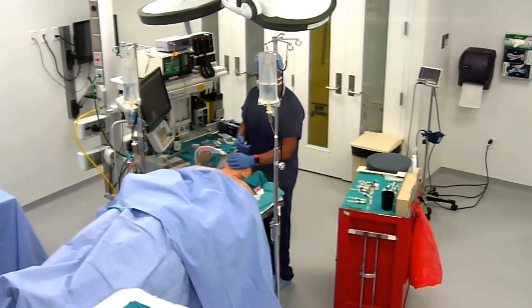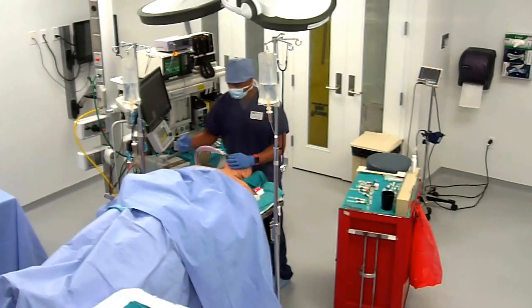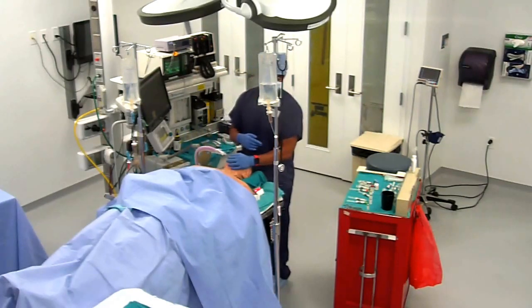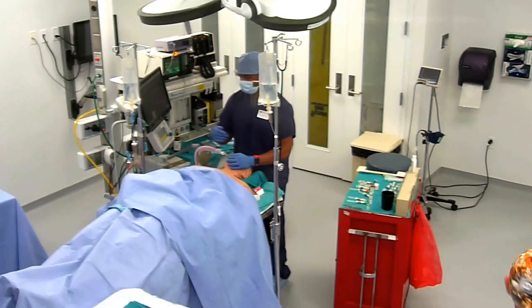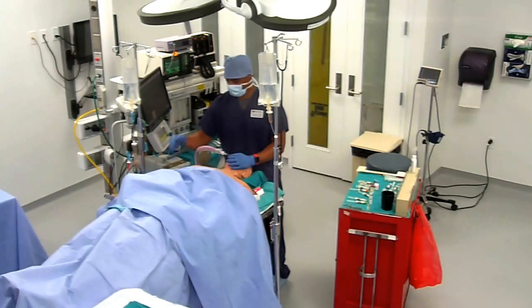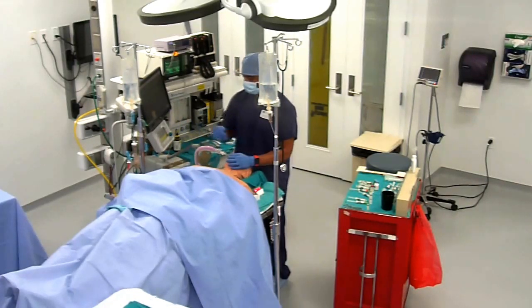Okay. I want to assess for twitches. How much Zofran do you get? 4 milligrams, which is 2 mils? 4 milligrams in the vial. Okay. She'll get it for you. We don't have it in here. Okay, give them Zofran, 4 milligrams IV push.